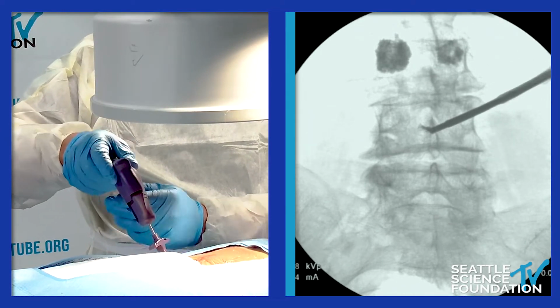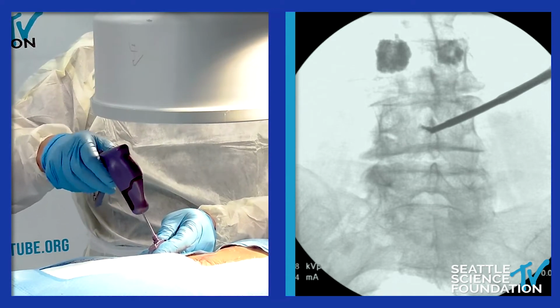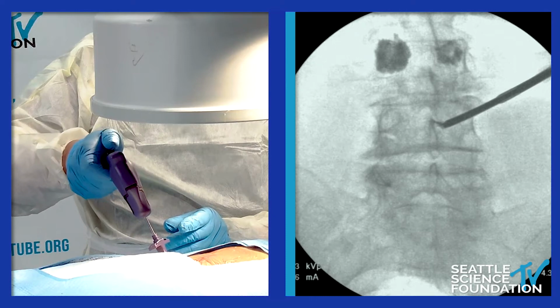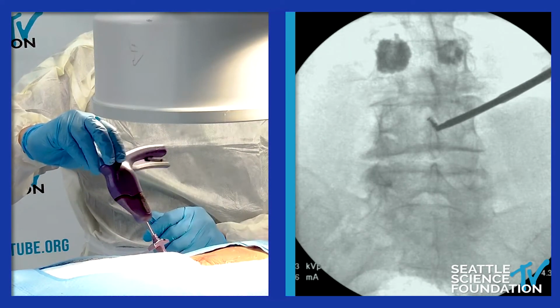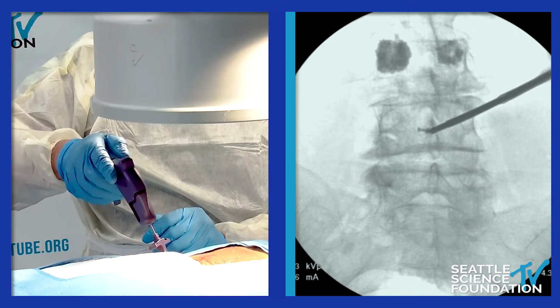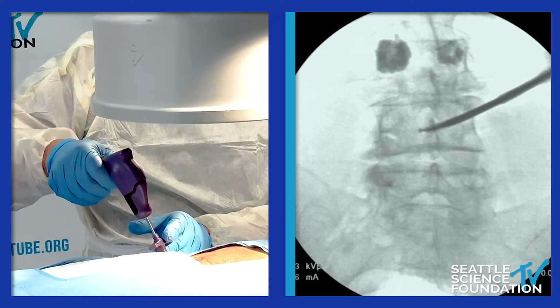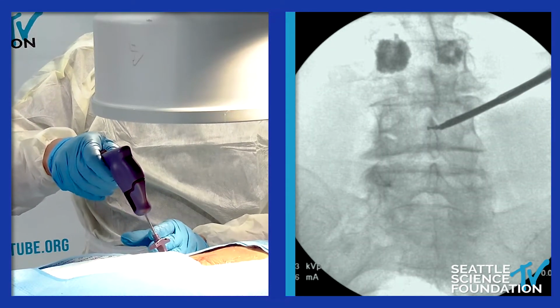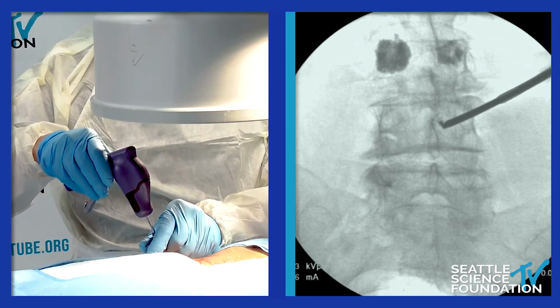Of course, this bone is not osteoporotic, but it's a lot of bone shards providing some resistance here. But of course, being careful not to cross any of the end plates there, and finding different depths. I'm going to back up my trocar a little bit.